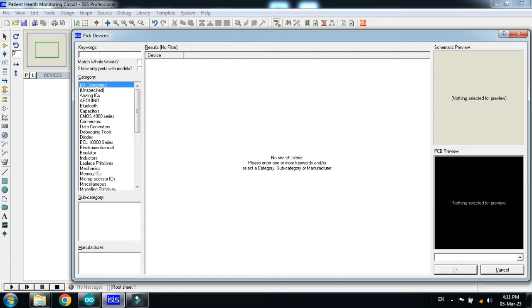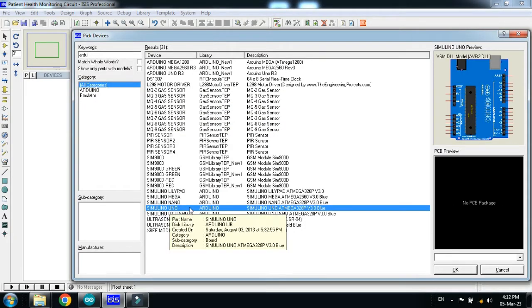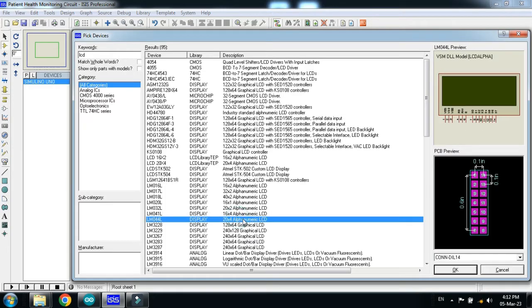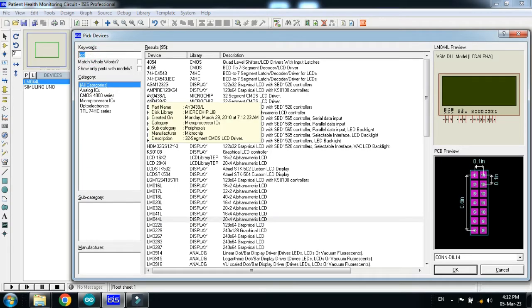Select the relevant components required for this project. First of all, pick the Arduino Uno — search for Arduino and choose Arduino Uno, then double click on it. Now search for LCD and pick the 20x4 LCD, double click on it.